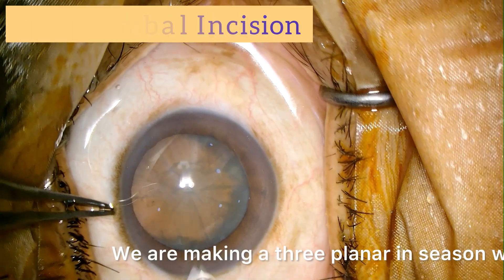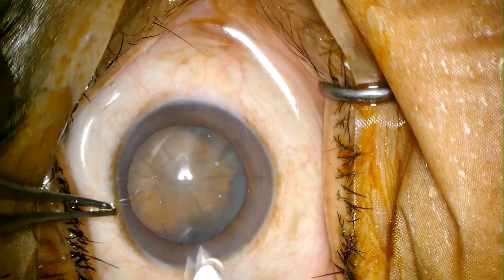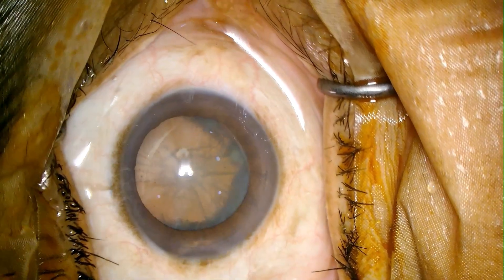We are making a 3-plane incision with 2.8 mm incision size. Entry is done.